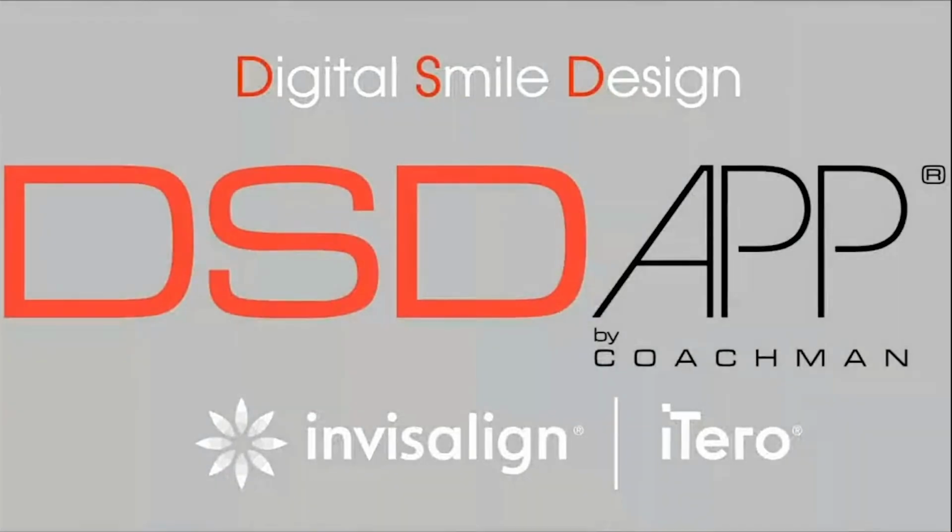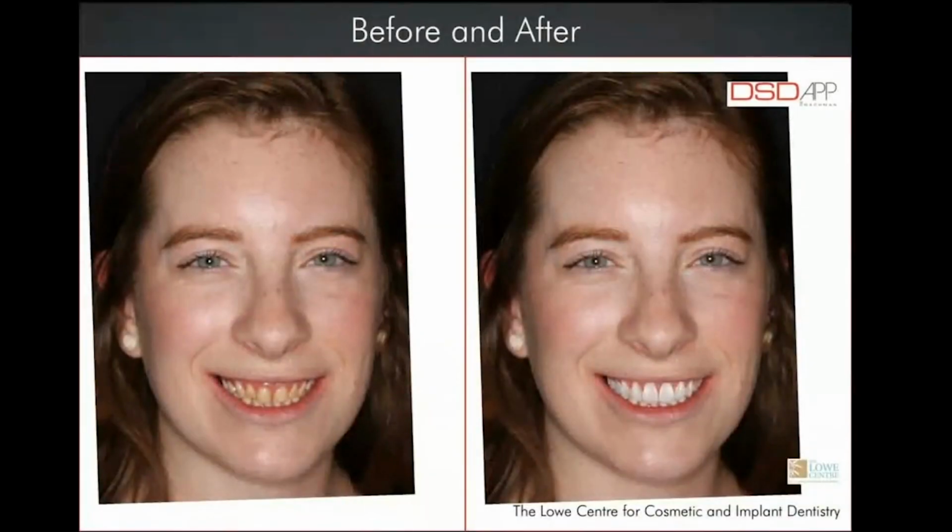Okay, so what do you do? So Digital Smile Design is one of the apps. You can use Smile Cloud DSD, Smilefy, a lot of different ones out there. But I like to do that to give the patient an idea what they could look like, realistically, and kind of design something. So I'd love her to look like that in the end if we could. And so this gives her an idea of what she's going to look like.